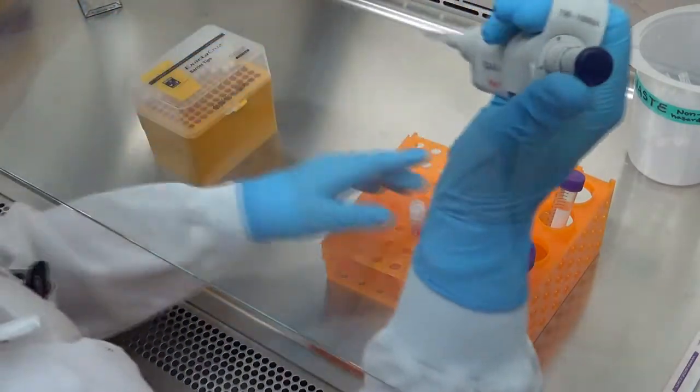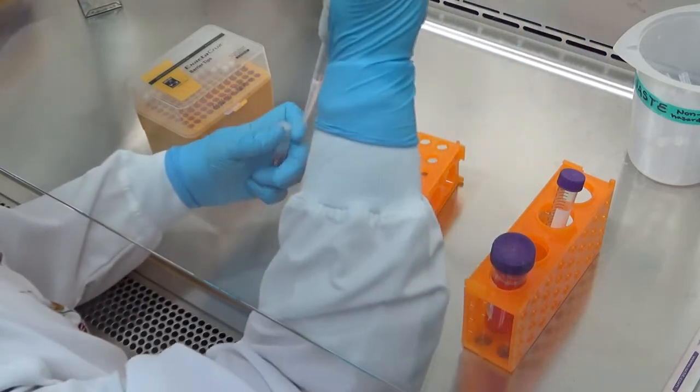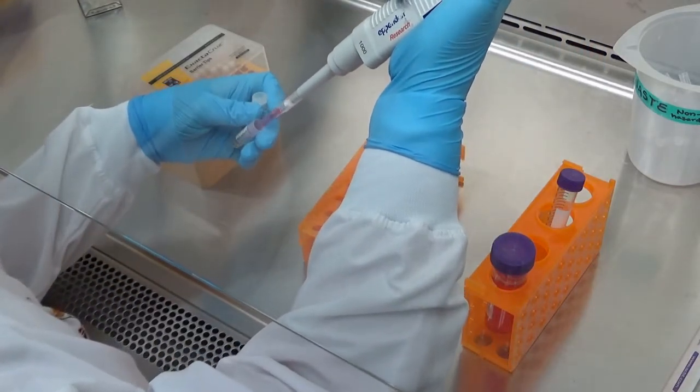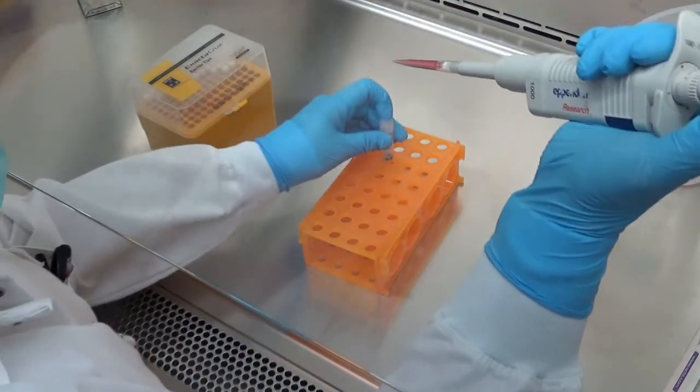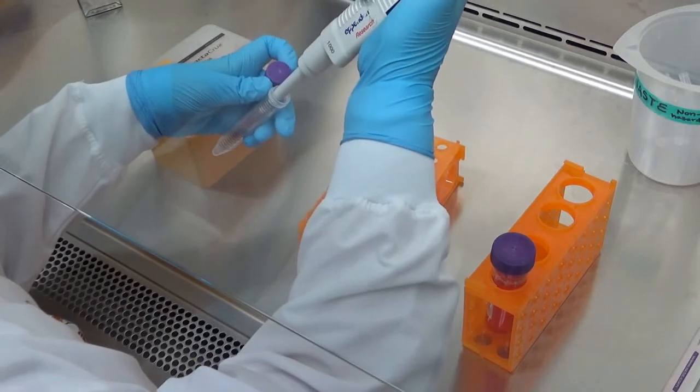Spray a Kim wipe with ethanol and wipe down the outside of the cryotube before placing it into the hood. Always remember to spray your gloved hands with ethanol before performing any cell culture activities. Begin by transferring the contents of the cryovial into a new 15 milliliter tube.